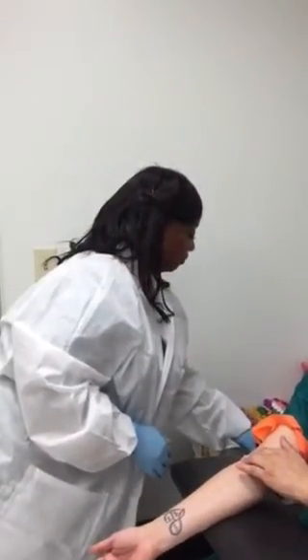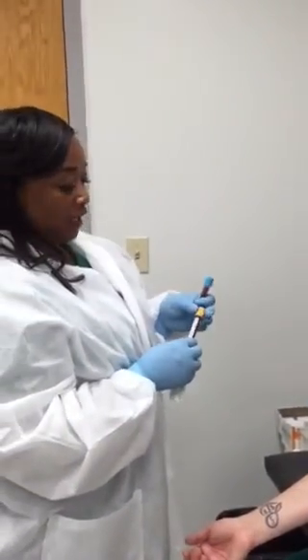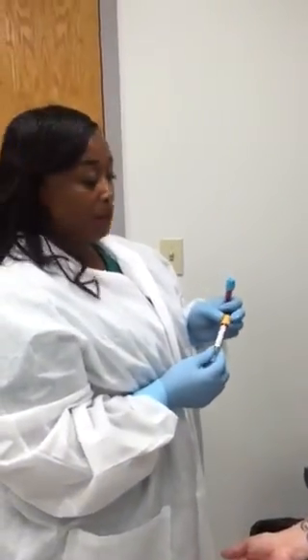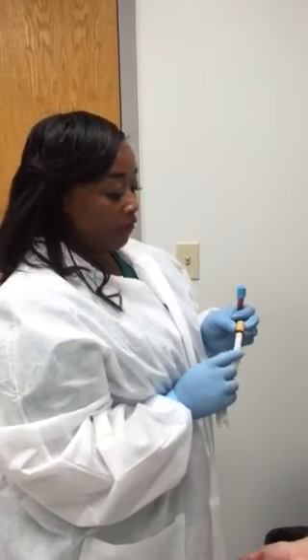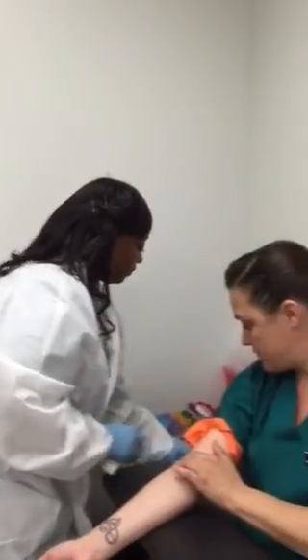At this point is where she will label the tubes. So Teresa, what's the information that goes on the tube? It's going to be the patient's name, patient's date of birth, MRN number — which is the medical record number — the phlebotomist's name, initials, the date, and time. Excellent. Thank you.